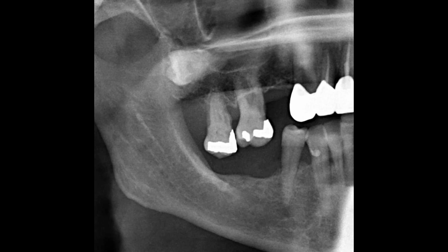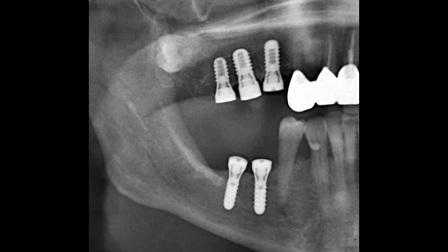We made a plan to do an implant surgery, so we placed five dental implants — two into the mandible and three into the maxilla. The mandibular surgery was conventional and went fine. The upper was an immediate surgery and we were happy with that as well.